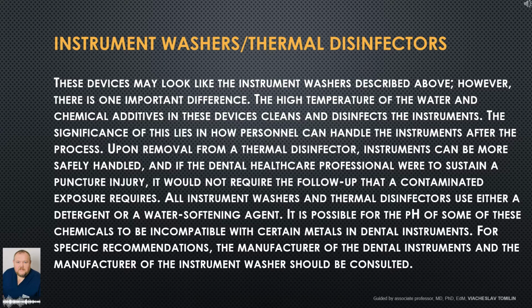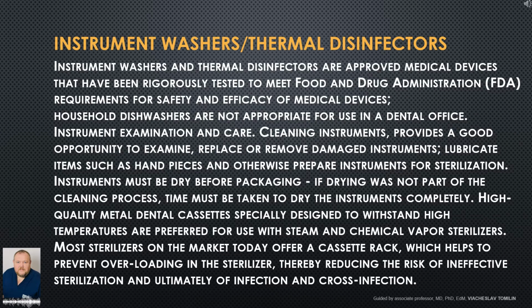All instrument washers and thermal disinfectors use either a detergent or a water softening agent. It is possible for the pH of some of these chemicals to be incompatible with certain metals and dental instruments. For specific recommendations, the manufacturer of the dental instruments and the manufacturer of the instrument washer should be consulted.